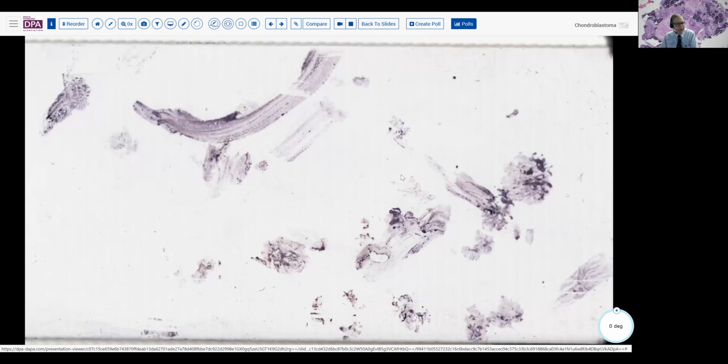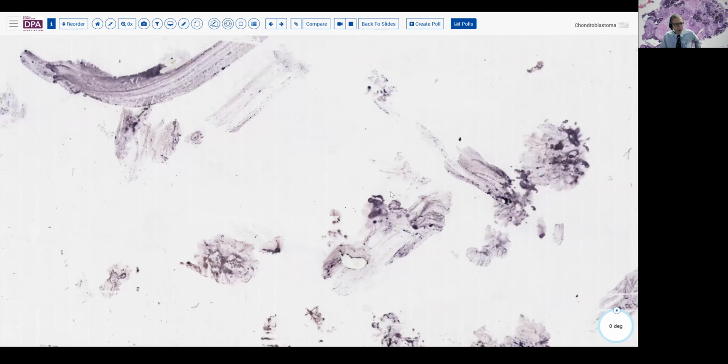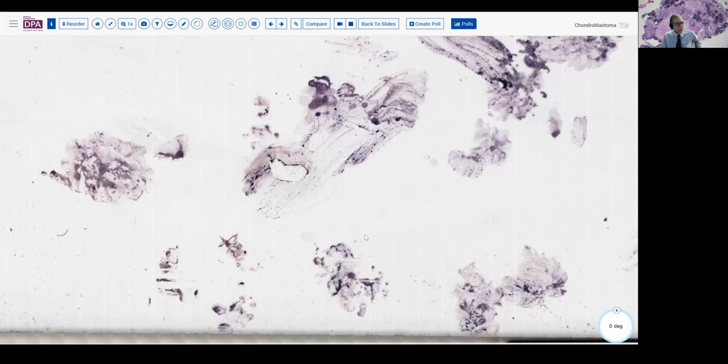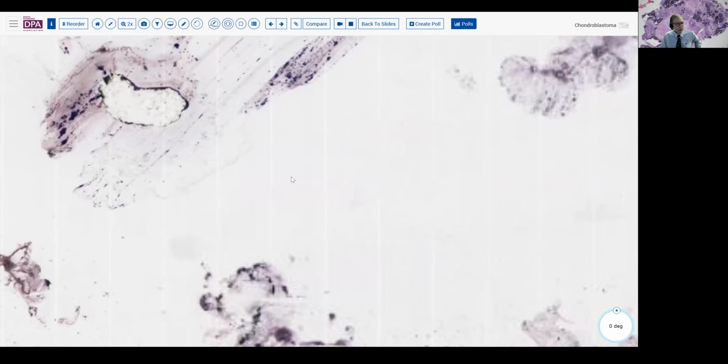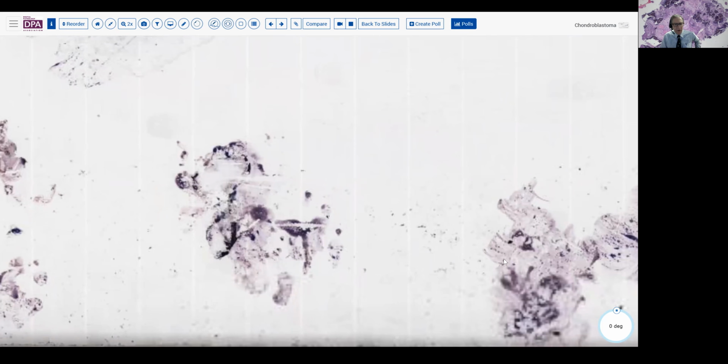So the surgeon gained access through a lateral approach and sent us a fragment of tissue that was quite calcified. We'll just show you here the touch preps, which is one of the techniques that can be used to try to evaluate such tissues that may not cut particularly well. As you can see, it didn't smear particularly well either.